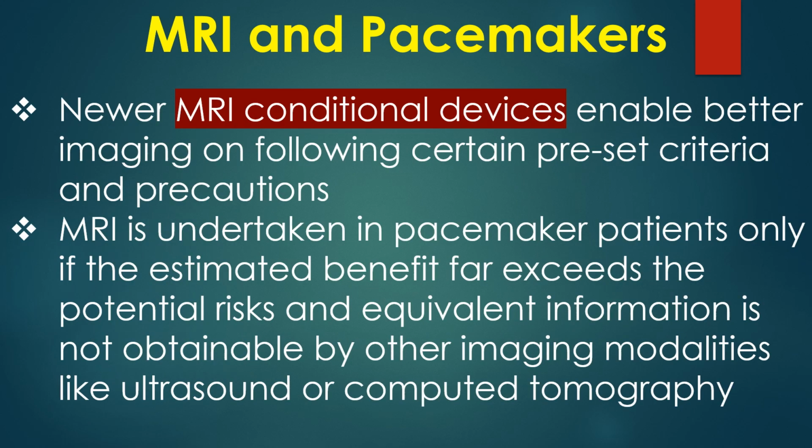Newer MRI conditional devices enable better imaging on following certain preset criteria and precautions. MRI is undertaken in pacemaker patients only if the estimated benefit far exceeds the potential risks and equivalent information is not obtainable by other imaging modalities like ultrasound or computed tomography.